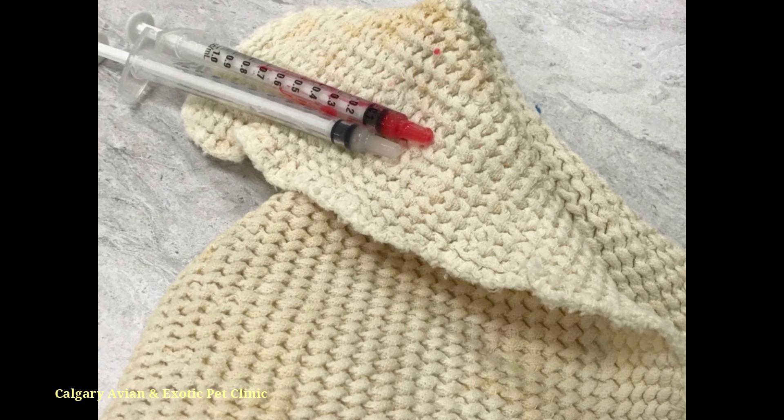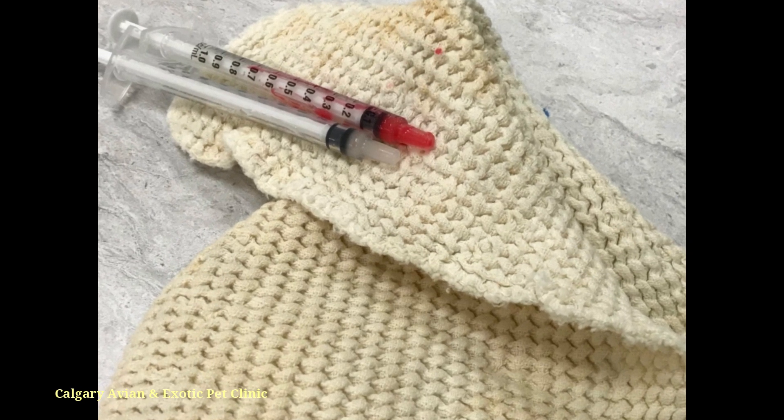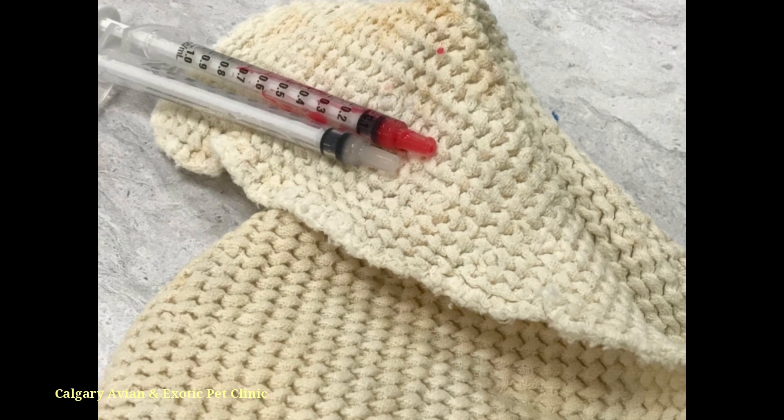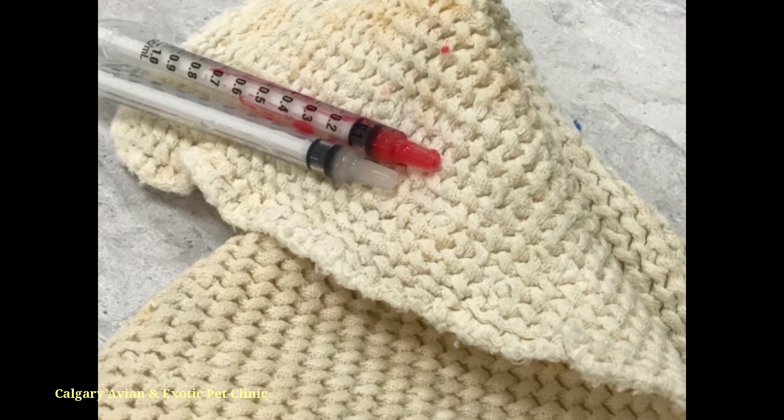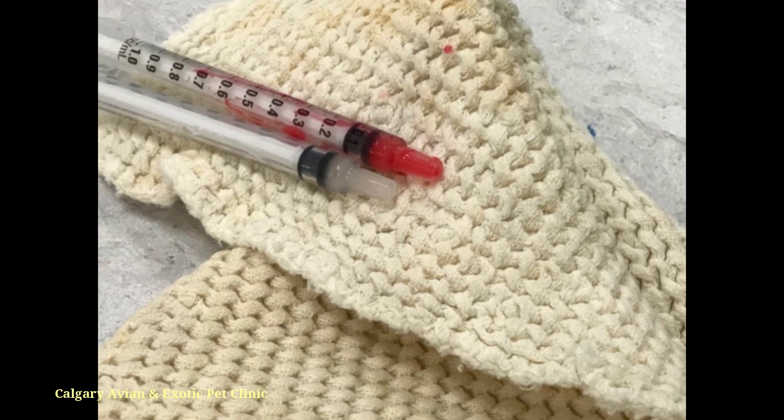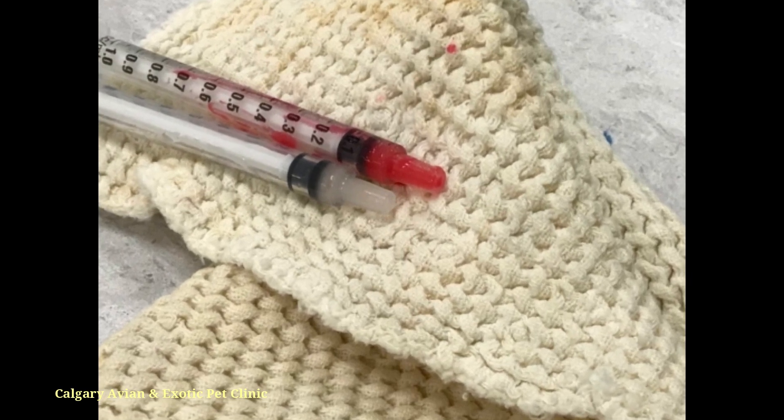The only thing to note about the tip of the syringe is that it often will have leftover liquid remaining in it after you have given your pet their medication. Do not worry about this leftover liquid — just dispose of it when you are cleaning your syringe.